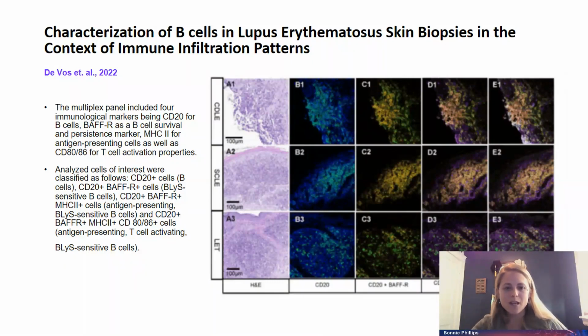So this particular study did show that the presence of altered lymphoid populations within certain individuals could be relevant to a histological assessment in regard to B cell populations, and this may actually be beneficial to better tailored treatment decisions, and that some cases may need a therapy that's targeted more towards B cell populations.